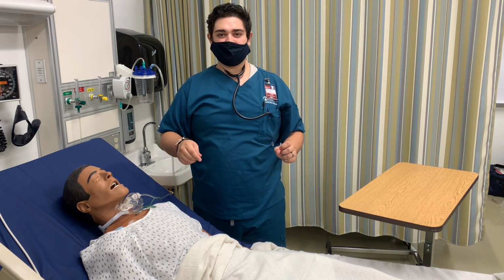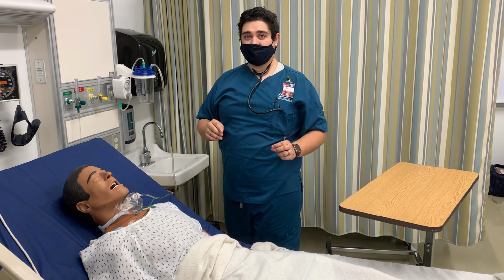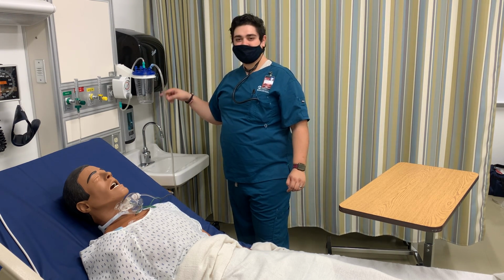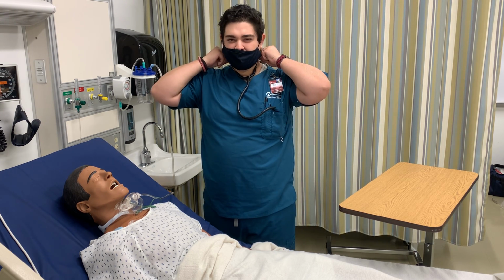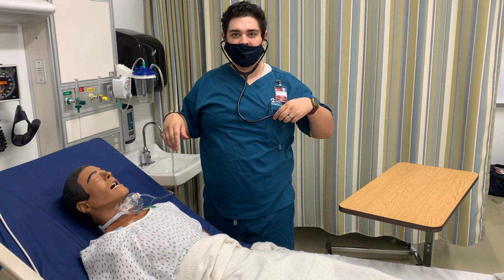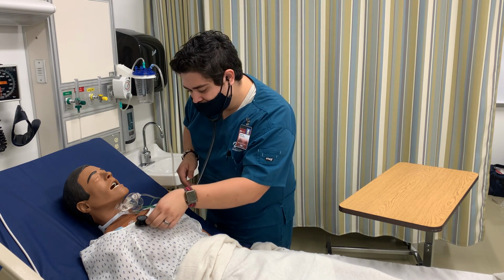the respiratory sounds, which I will reassess here in a bit. I also would assess the sputum that had came out in the suction, the color, and about how much, which is hard to tell with there was saline solution in there. So I will do one more respiratory assessment here.